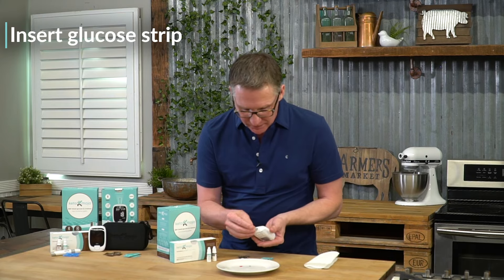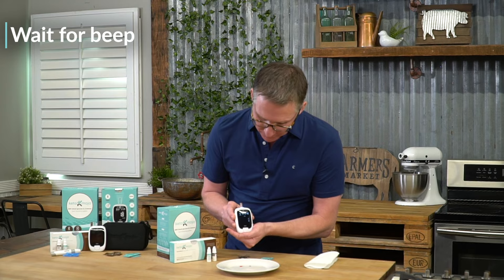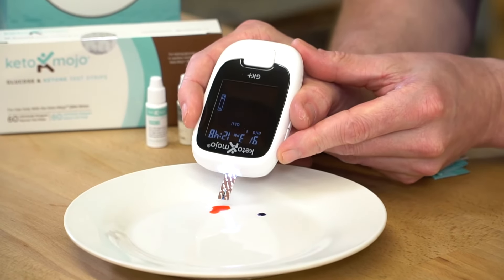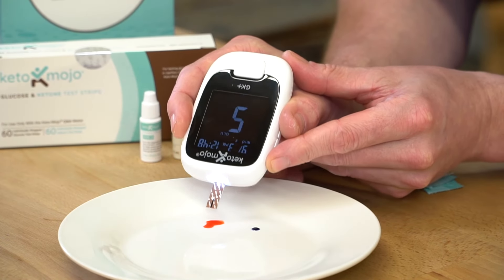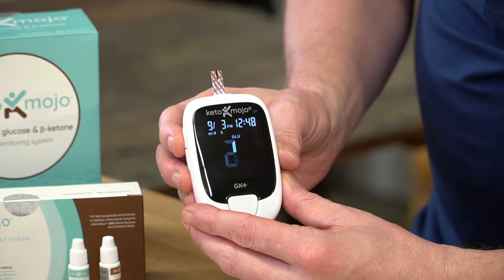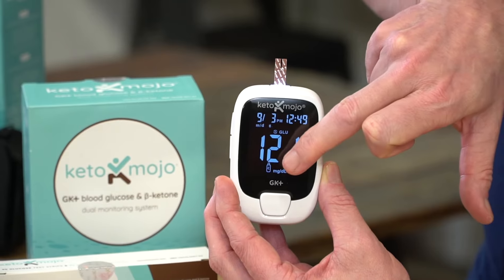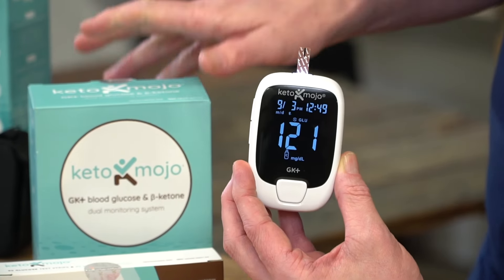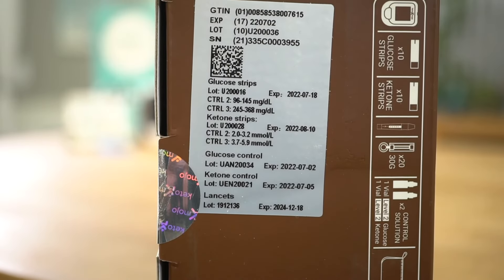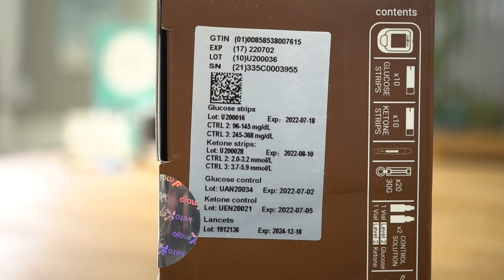You're going to place the glucose strip into the meter, like so. It's ready to test. Bring the glucose on the red there — we're just going to sip a little bit up, like that. It will count down. This came up with 121. We can see it has 'control' on there, so it knows it's a control. Looking at the kit, level two range should be between 96 and 145, so we are well within range for our glucose sample.